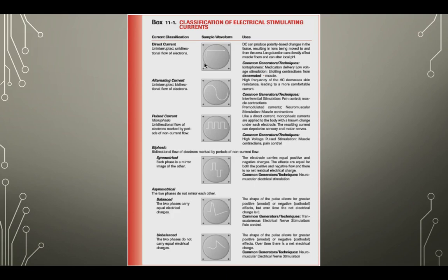Alternating current is what the electricity that comes into our homes and our buildings uses, and it flips the poles on the battery. So normally in the DC current, electrons come out of the negative pole, the cathode, go through the resistor, in that case the light bulb, and then come back to the positive pole, the anode.